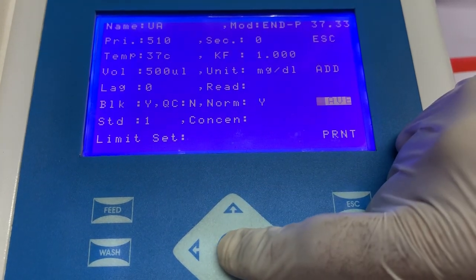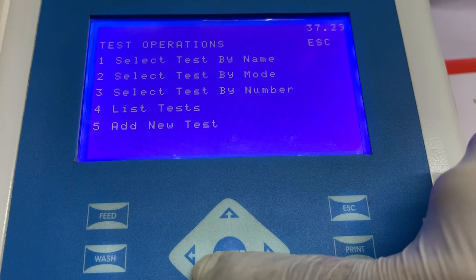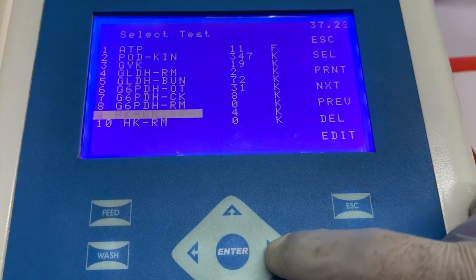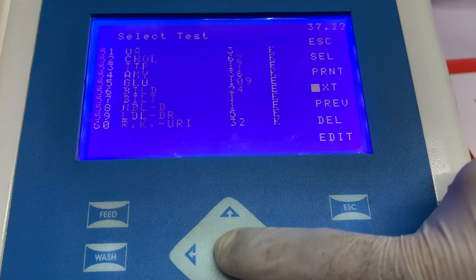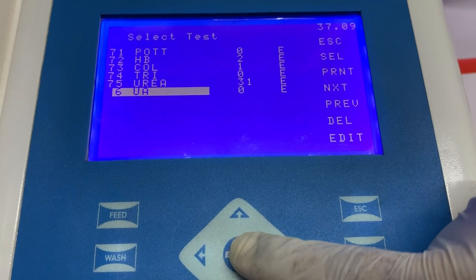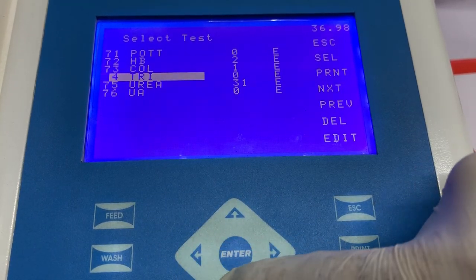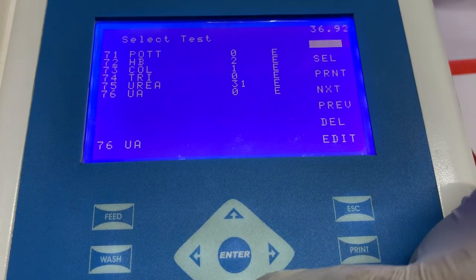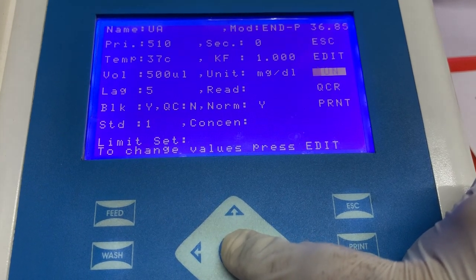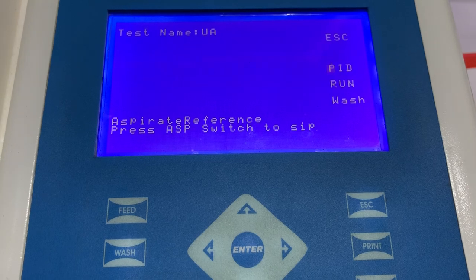Now, as you can see, all the information required to program the software has been added. So now we can select the option save and the program will be saved in the instrument. To view the program, go to list test and navigate to the screen where our program has been saved. In this video, our program has been saved on position number 76. To open the program, select the option. If you want to run any patient sample, select the option run and the instrument will guide you on how to take the absorbance. Thank you, and we hope this video has been helpful for you.